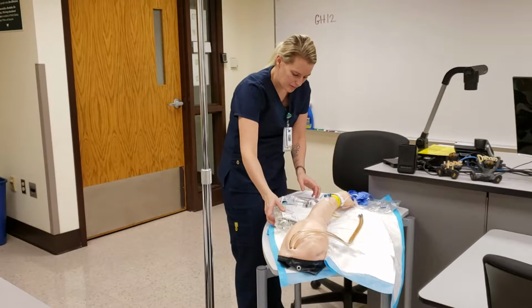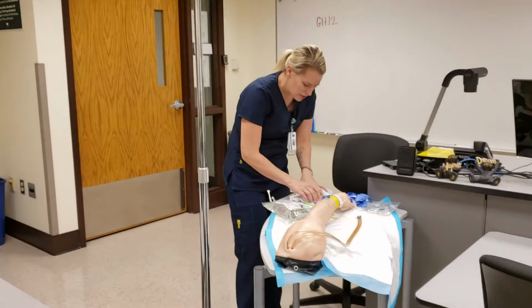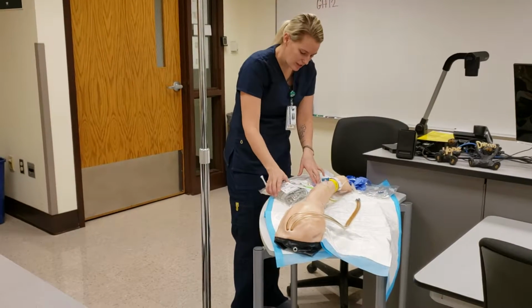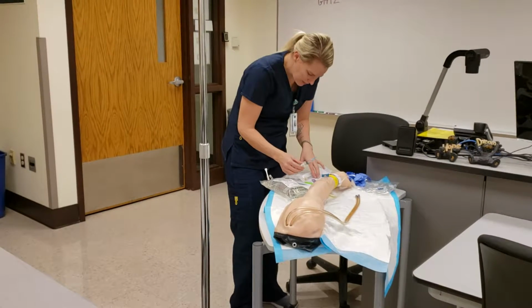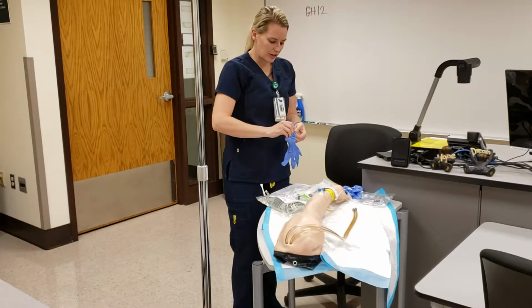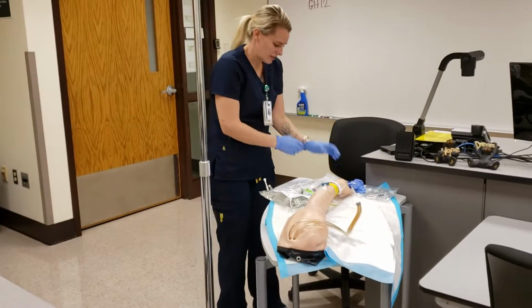So I'm just going to do my third med check here at the side of the bed. So the doctor's ordered the IV fluids with the potassium in it for you. So we're going to do the 1,000 milliliters of lactated ringers with 20 milliequivalents of potassium, 200 milliliters per hour. And then we have the morphine here. Morphine, 0.5 milligrams. IV push every 2 hours. Okay, perfect. All right, Shirley, so I'm just going to go ahead and get this medication started for you, but I'm going to start by flushing your IV. Does it hurt at all? Okay, perfect.